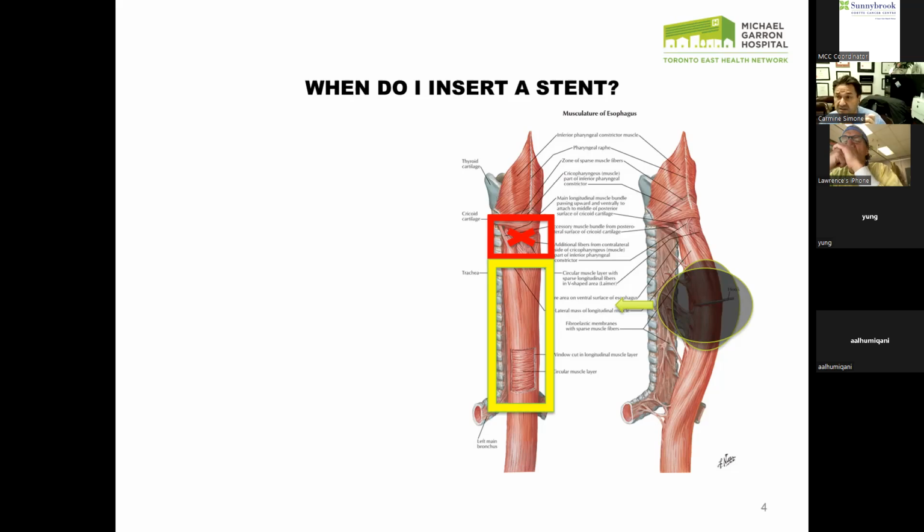And we have had instances where we deploy a stent, big bulky tumors, and I mean 5 centimeter bulky tumors, and they can completely or almost completely obstruct the trachea. Patients can wake up with stridor. They can wake up with acute respiratory crisis. So we just have to be very careful. And so for those patients, big bulky tumors, if the airway is already compromised, I do not recommend a stent.